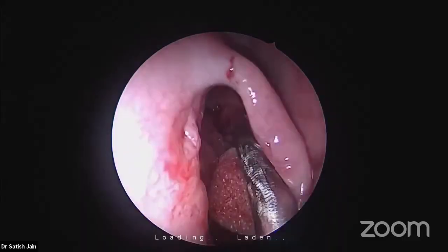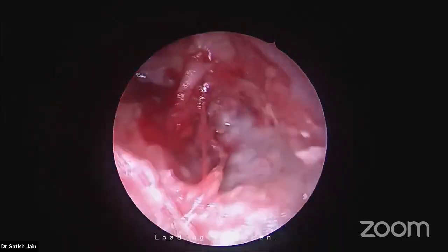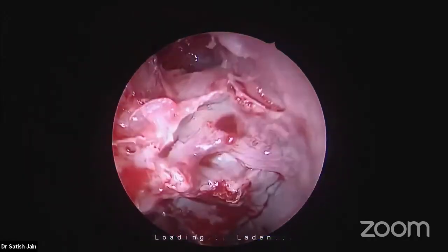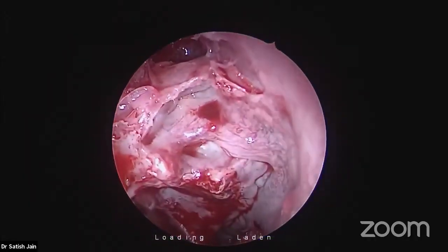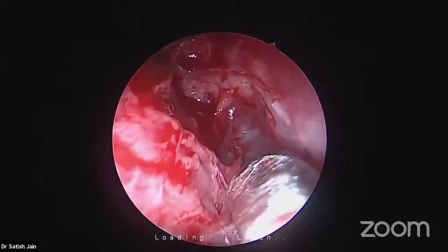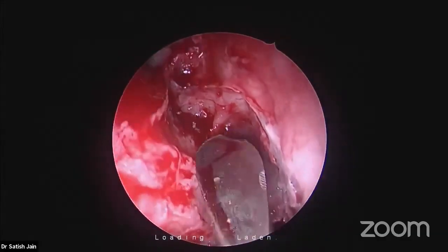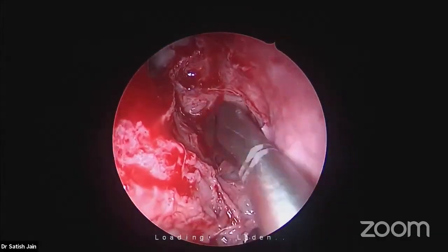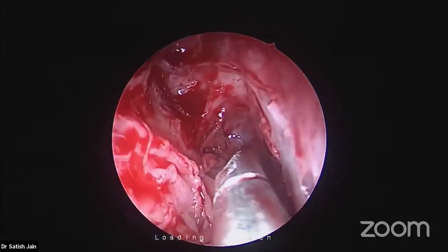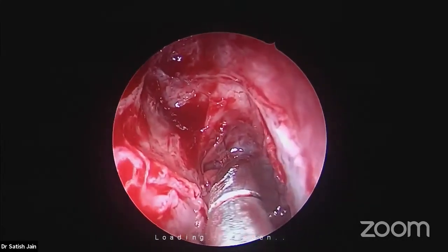This ground lamella's superior attachment to the skull base is a few millimeters behind the anterior ethmoidal artery. Now see, this is the ground lamella. See its superior attachment to the skull base here. This is the ethmoidal skull base anterior to the anterior ethmoidal artery. This is the ethmoidal skull base behind the artery. And this is the area where the ground lamella is inserted on the skull base.